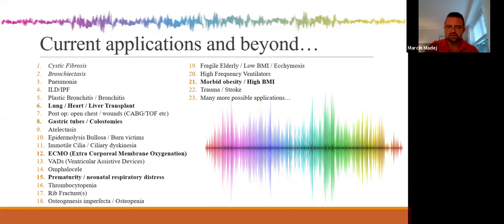And secondly, what Michael said too, it really is that sweet spot of that preset frequency of 40 hertz that a frequencer is at, but you play with the intensity, setting the intensity depending on our patient and what they can tolerate. So again, with our micro preemies and preemies, I would bring down that intensity pretty low and see what the child is able to tolerate. But through research, and there's quite a bit of research out there for the frequencer, the 40 hertz seems to be a really nice sweet spot for airway clearance.